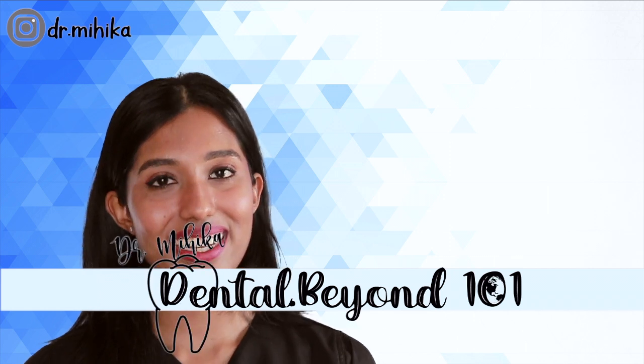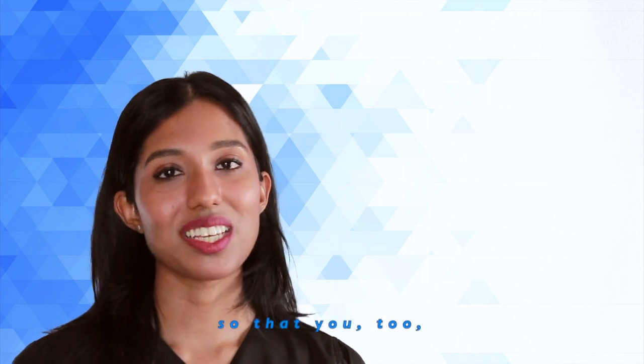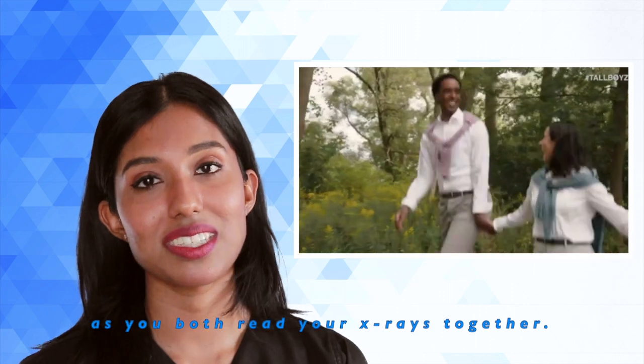I am Dr. Mihika, and today we shall be decoding some black and white images so that you too can be on the same page as your dentist as you both read your x-rays together.